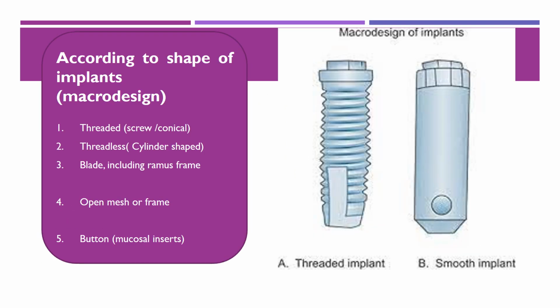Coming to the classification according to the shape of implants, there is the macro design type. We have the threaded type, threadless type, blade type, open mesh frame, and button type.